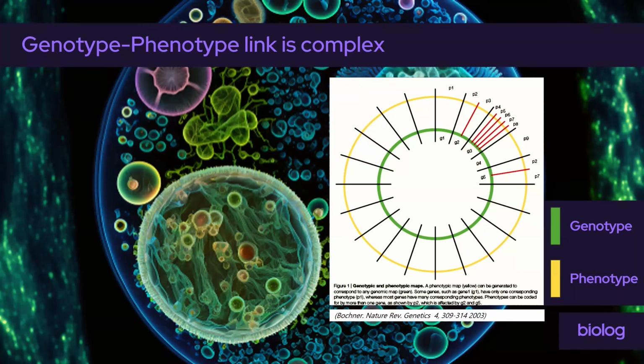And of course, there are lots of traits that are controlled by many genes, which really makes organisms more robust to mutations. This is especially true for traits that are important for survival and reproduction. And so we really believe that phenotypic information gives you a more comprehensive view of all of these meaningful functional traits of a cell or an organism.